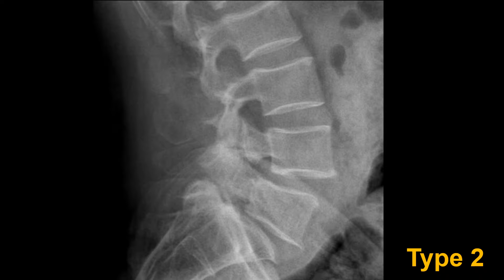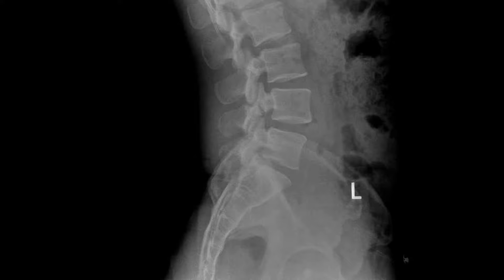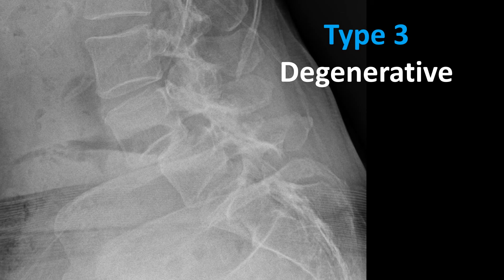In this example there is a spondylolysis or pars defect of L4 but no obvious evidence of anterior translation. This would be referred to as a spondylolysis of L4 without evidence of anterolisthesis.